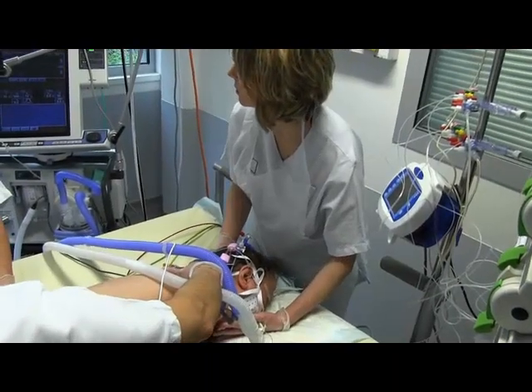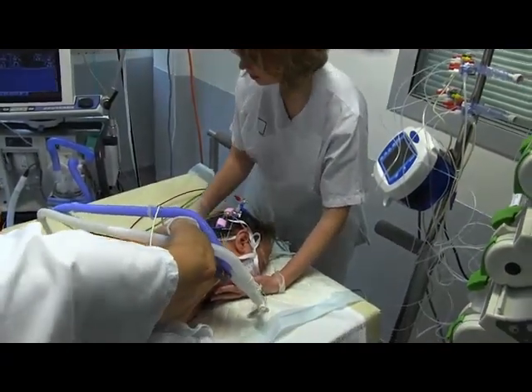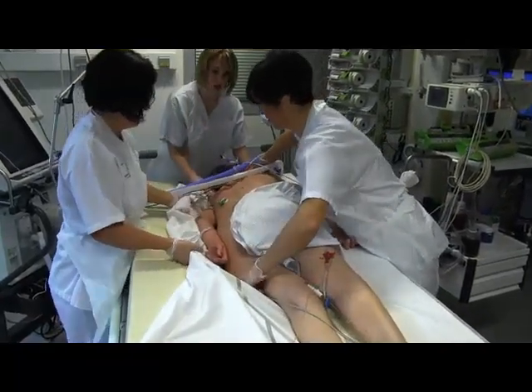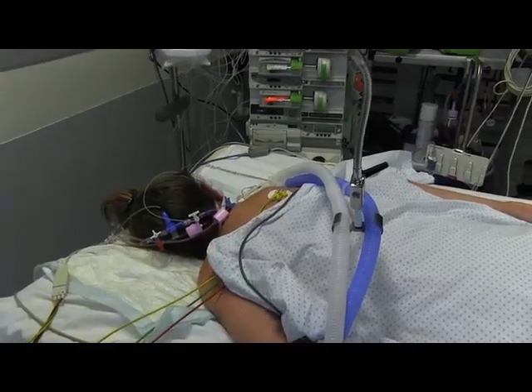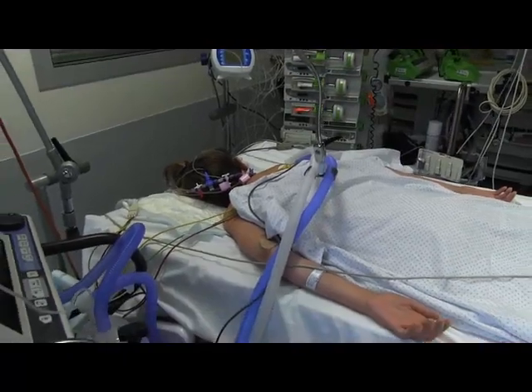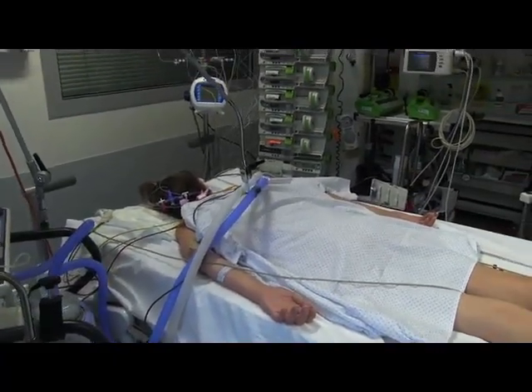The fourth step is complete proning. The new bedsheet is used to pull the patient and to move them into the final complete prone position. The body is placed in a horizontal position at 180 degrees. The abdomen is usually not supported. The upper limbs are placed alongside the body.